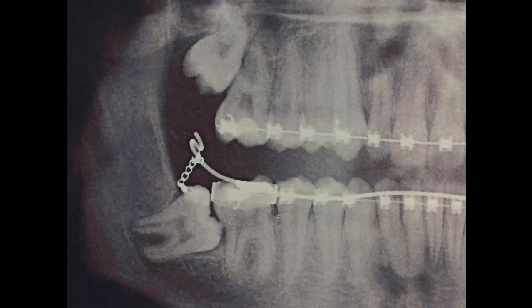Now here's one my son sent in to me that somebody had been told how to activate them. You see, this wire probably had a lot of spring pressure, and they put this on it and push this down and tie this little chain to that deal, but the chain is bonded on back here, so it's trying to pick the whole tooth up while the thing's laying down. It's just ridiculous. All you have to do is come over on this side of the tooth, bond something on there, put a spring in this area right here, and you raise it up, you put your hook on it, then put it back in the mouth, activate it, and activate it more here, and it'll just take that tooth right out of that spot. And this is ridiculous. Somebody just didn't really know mechanics, or didn't understand how that tooth needed to raise up when they built this thing.